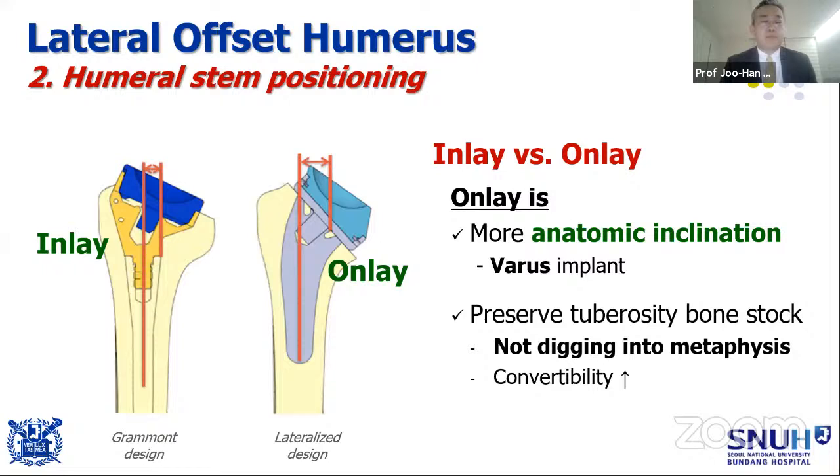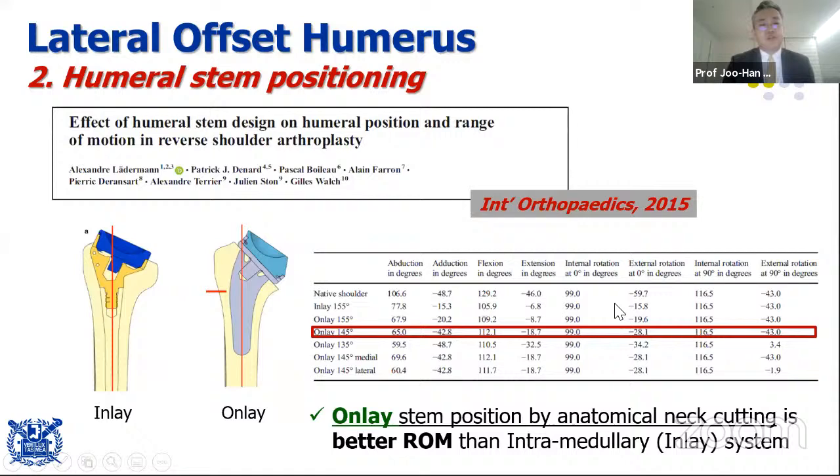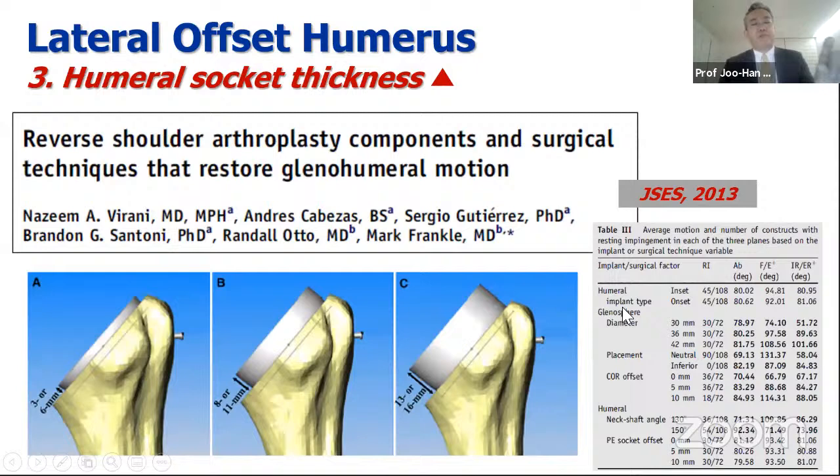Humeral stem positioning is also a way of lateral offset. As you see here, the right side onlay involves much more neck cutting at around 155, while 135 is a more anatomical inclination with the varus implant insertion. And we don't have to dig into the metaphysis with this kind of onlay positioning. So we can preserve the tuberosity or the metaphyseal bone stock, and it also gives better range of motion compared to other inlay systems. Also, if we can put in a thicker socket or thicker humeral tray, it gives better range of motion.